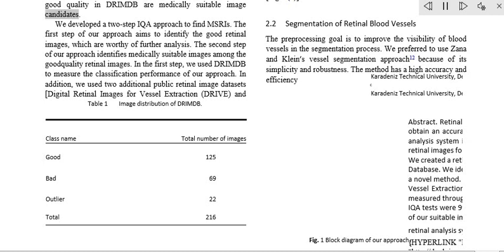On the vessel segmentation process in retinal images. In detail, the method uses simple morphological operators to extract blood vessels of a retinal image. OD detection.